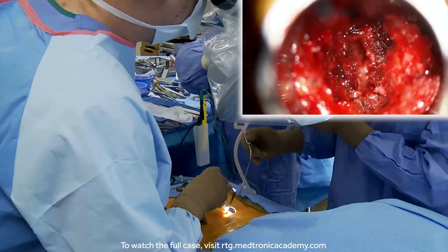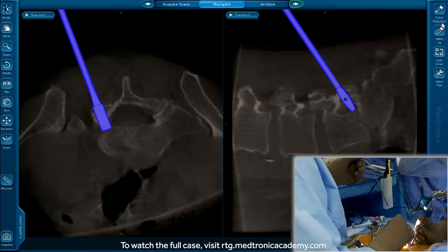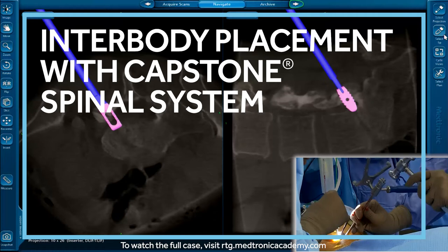So this is a navigated trial, and we can place this down. And the great thing about this is it's gonna show us how big it is, and is it the right length, and where is it positioned within the disc space. So we take our Capstone biomechanical device. And remember, I'm trying to get a little more medial.